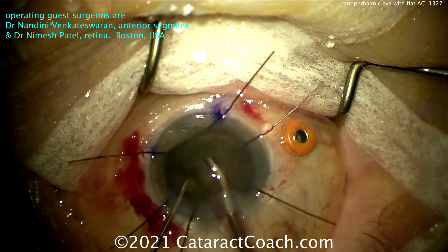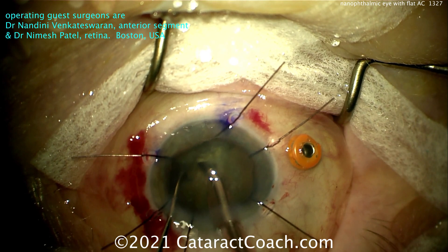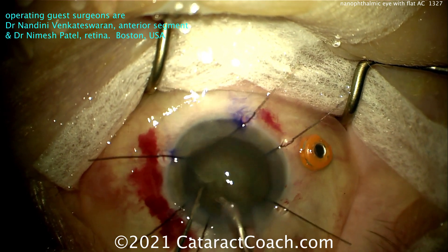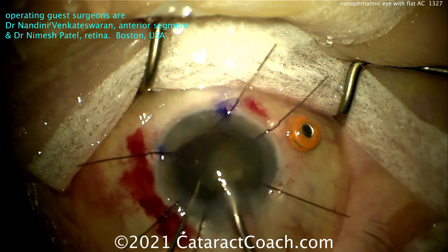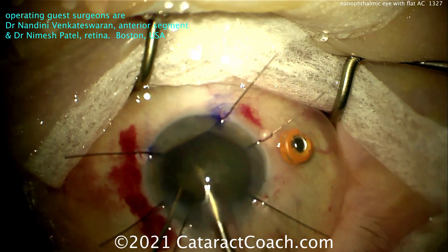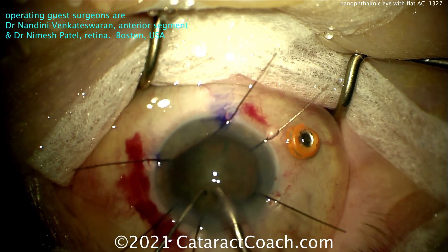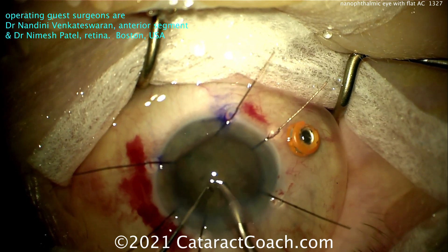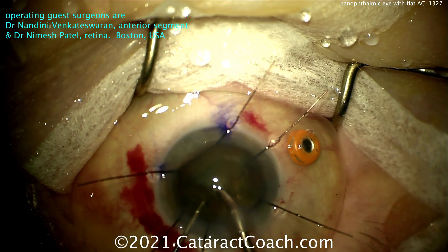Now, if you are going to do this, it's very important. First, know where the pars plana is. Second, you have to check to make sure you don't have an entry site break after you put in that vitrector. You also want to do it very cautiously — only move a little bit at a time, baby steps. The sleeve was placed on top of the vitrector so it would only go inside the eye a certain depth — just a couple millimeters. Don't hit the crystalline lens or the back surface of the posterior capsule with the vitrector, or you'll be in a world of trouble. Here it was done just beautifully.